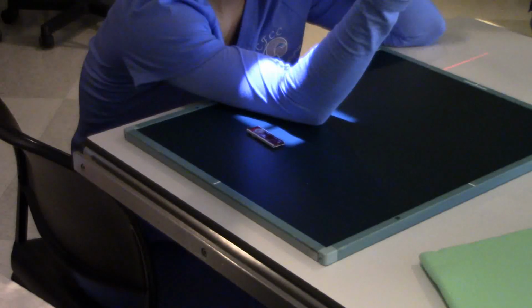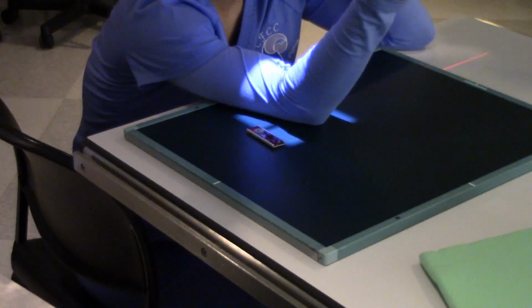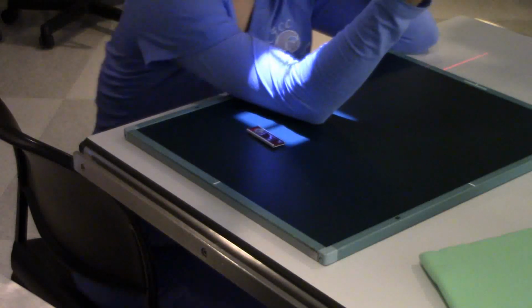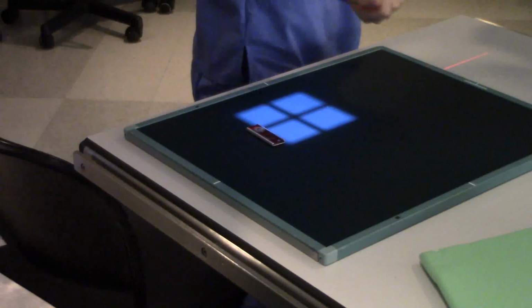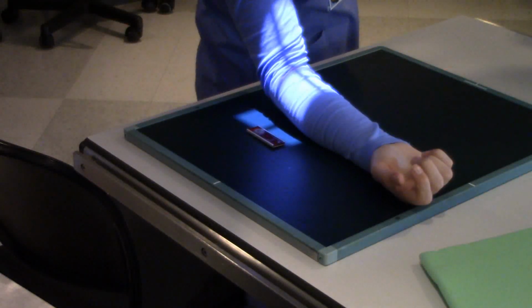Now, we can't straighten the lady's arm out. It's going to have to be something like that. How can we get her in such a position? Stand up. I think that's a good idea. Like that? Yes, just like that. Okay, ma'am, there you go.